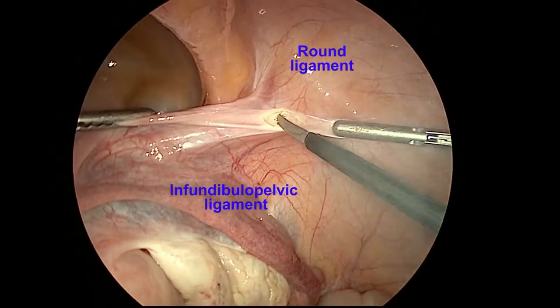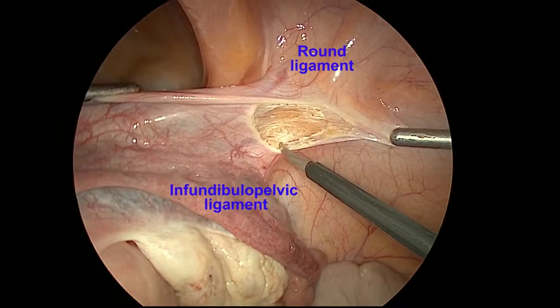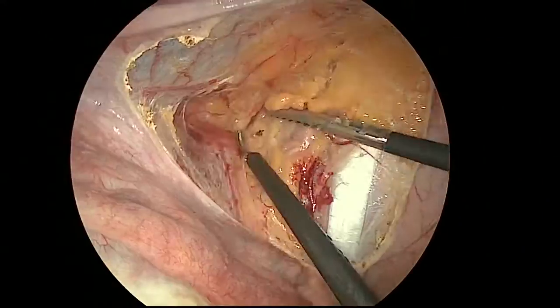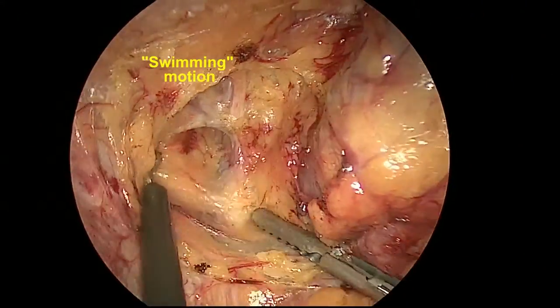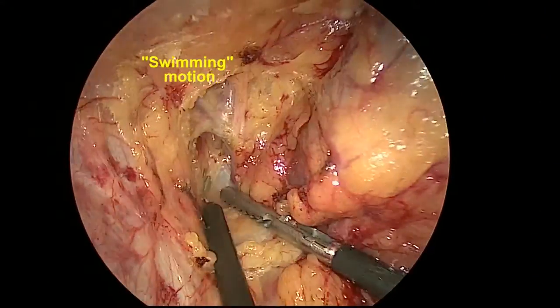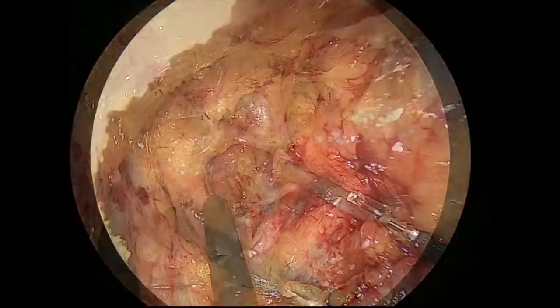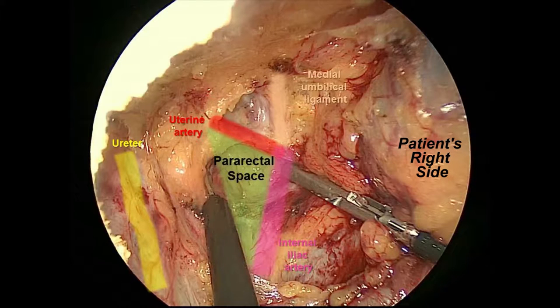The pararectal space can be entered by opening the sidewall peritoneum at the level of the round ligament parallel to the infundibulopelvic ligament. To open the space safely and efficiently, the connective tissue is spread horizontally using both hands in a swimming motion. The pararectal space is bordered by the cardinal ligament anteriorly, the rectum medially, and the internal iliac artery laterally.